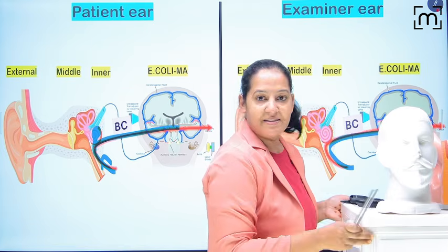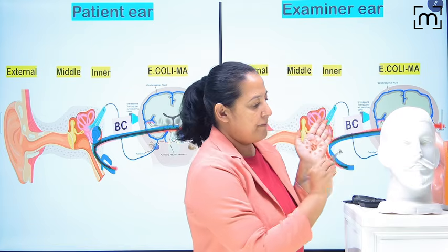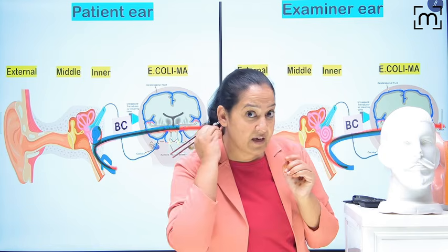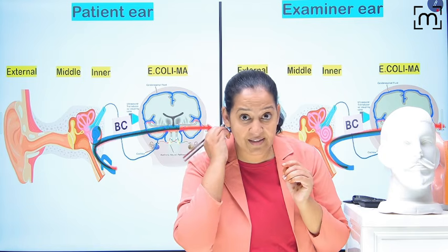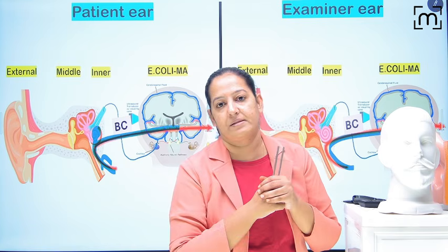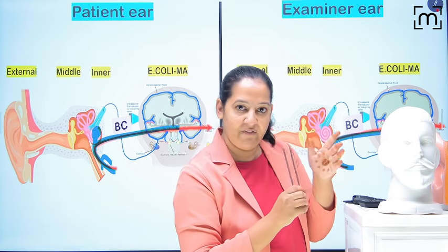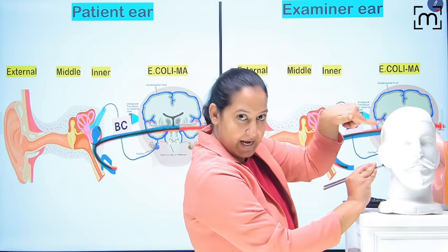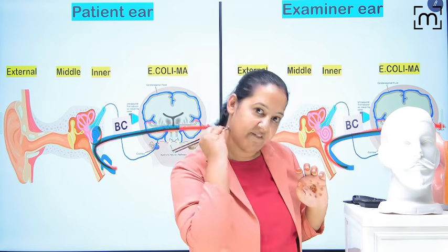My patient is having sensorineural deafness. So here I'm putting it. The patient's cochlea is not much activated. The patient says stop, but I can still hear it. So it is sensorineural deafness. But if the patient is having conductive deafness, the patient will hear the same duration, because the mastoid is directly activated, bypassing the conductive pathway, and I will hear the same duration.